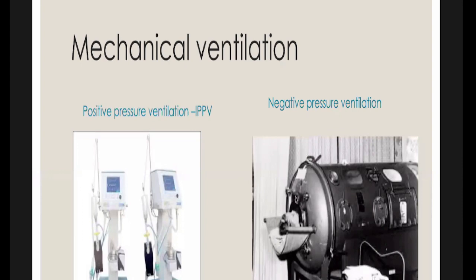But you can see this patient is not intubated. The patient is using his or her natural airway. So that is called an iron lung.